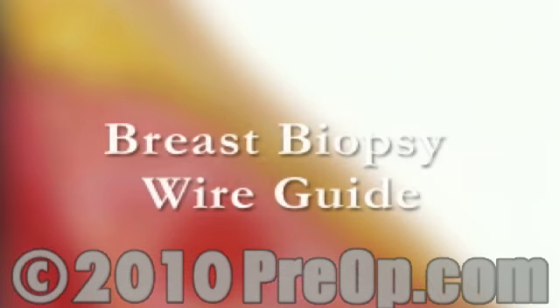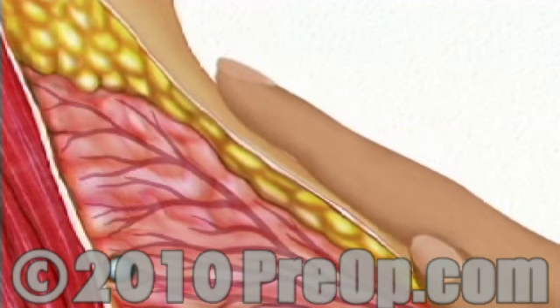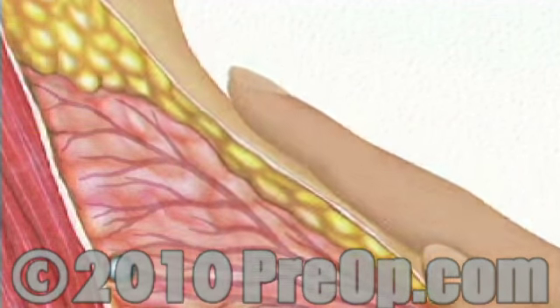Your doctor has recommended that you undergo a breast biopsy procedure, or lumpectomy. In your case, you have a lump in your breast which is too small to be felt by touch. Your radiologist detected this abnormality while reviewing your recent mammogram or breast X-ray.